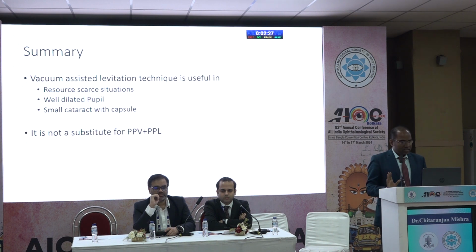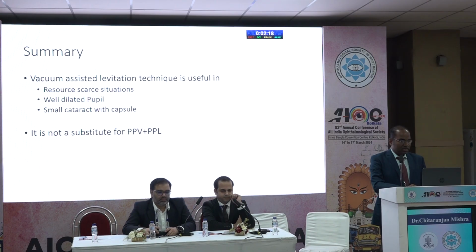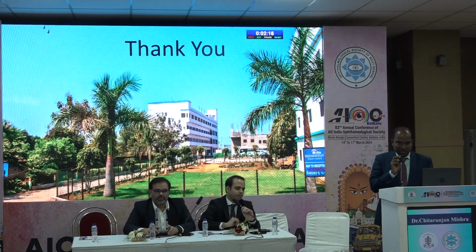However, I must tell you that it's not a substitute. PPV plus PPL, pars plana vitrectomy plus pars plana lensectomy, still stands as the time-tested technique for a dropped cataract lens. Thank you for your kind attention.